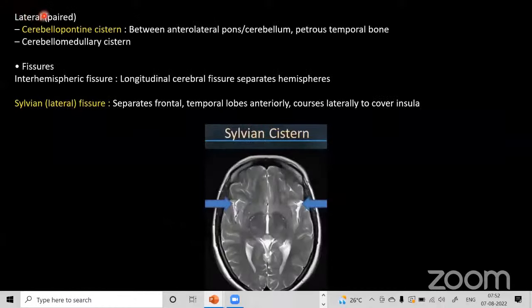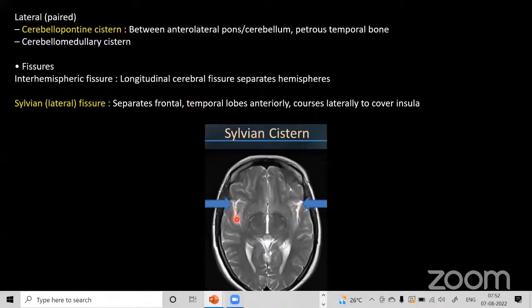The paired cisternal systems include the CP angle cistern and the cerebellar medullary cistern. Fissure-related spaces include the interhemispheric fissure and the Sylvian fissure, which separates the frontal and temporal lobes anteriorly — forming the Sylvian cistern.